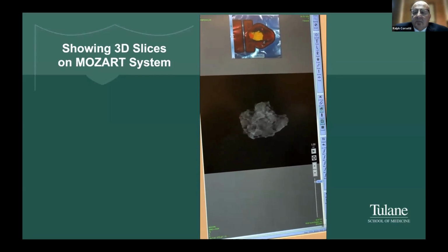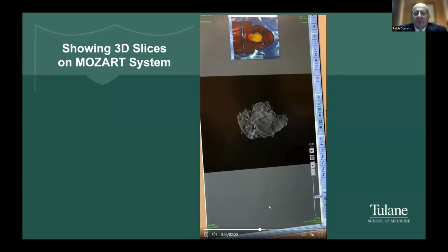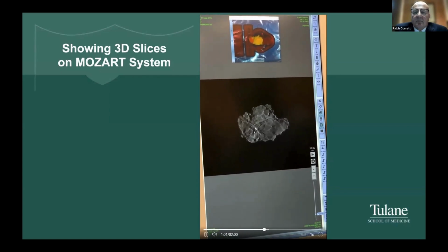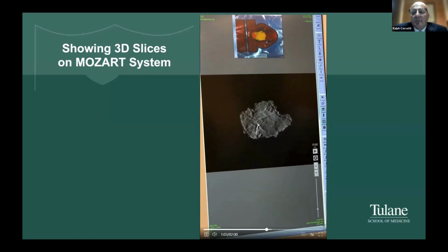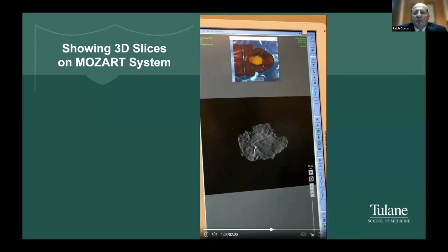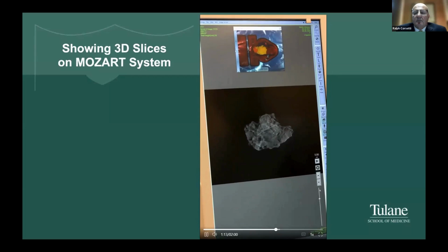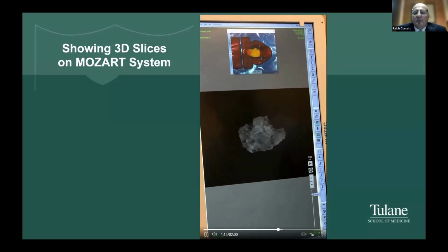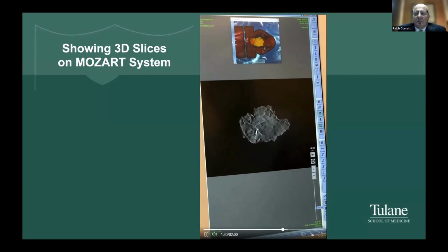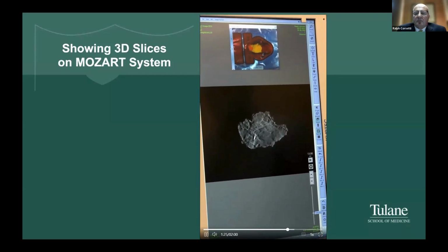So I'm quite happy with this specimen because we have more than 1 centimeter anteriorly. And posteriorly, we went down to the fascia. So I'm happy with this. And we also can then take our closest margin. And I'll scroll through here again. Perfect. Nothing anteriorly seen. Nothing posteriorly seen. That's in focus right there at about 14 millimeters from the anterior margin.